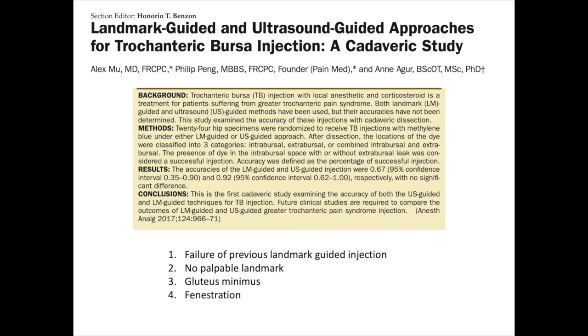And lastly, I think the major indication for ultrasound is when you want to perform fenestration. Well, why do you want to have a fenestration? Think about this. If you have a patient who has tendinopathy, not a tear, tendinopathy, which is an intrinsic disease of the tendon, no matter how much you inject on the surface of the tendon, it won't touch the disease. So in this case, you need to put the needle multiple times into the tendon, and you are much better off having ultrasound to guide you.